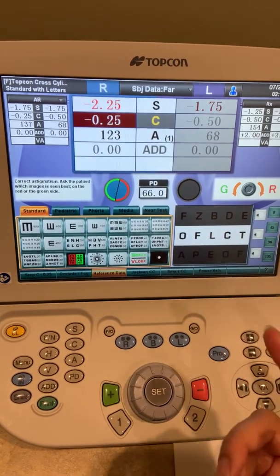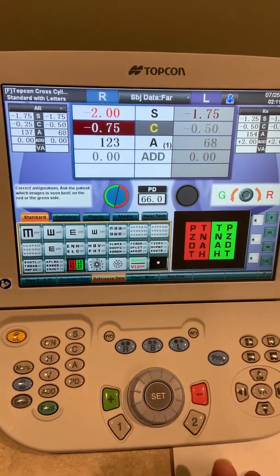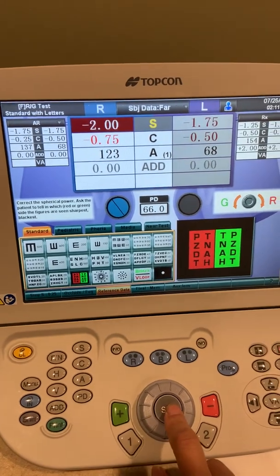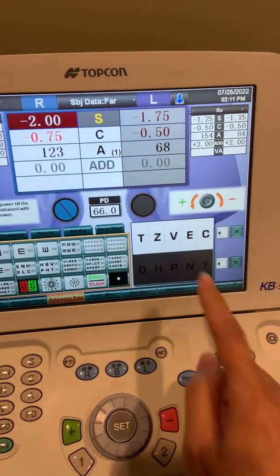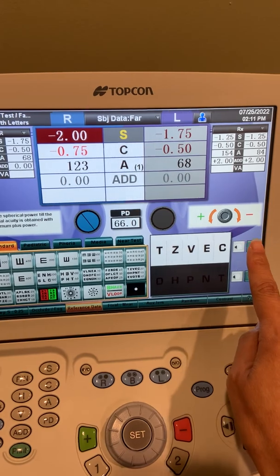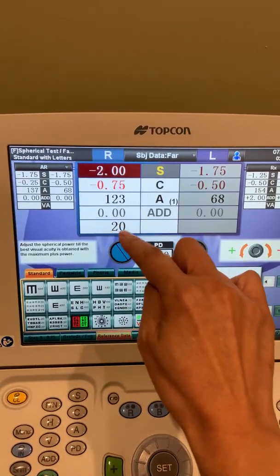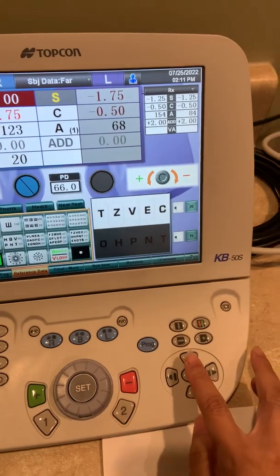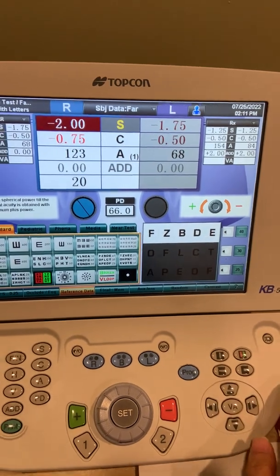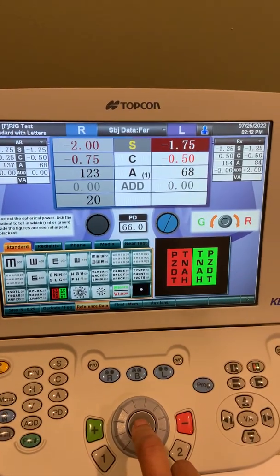Same idea here — red or green, which is best — until they say equal, then hit set. The next step will check the spherical power again. If it is equal, go ahead and hit set, and we'll move on to the visual acuity. Hopefully the patient will be able to see 20/20. Go ahead and press the screen here and it should show you that they are 20/20 and record it for you. If they are not 20/20, you can go ahead and move the screen up to 20/25, 20/30, whatever is necessary. Once you are finished with the right eye, you will hit set and then move on to the left eye.